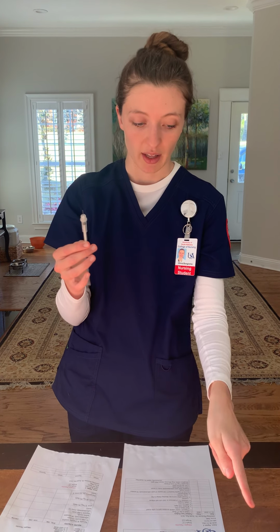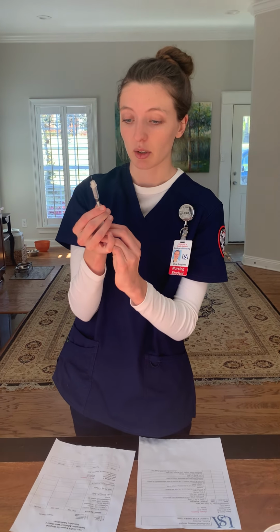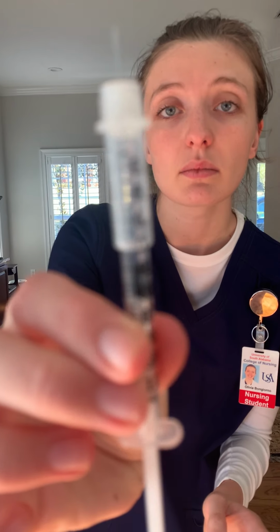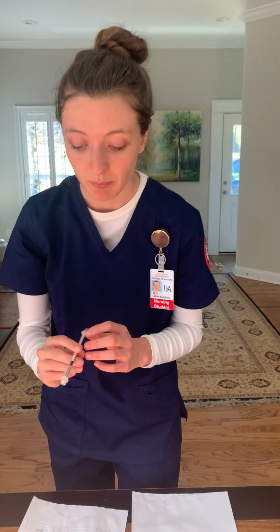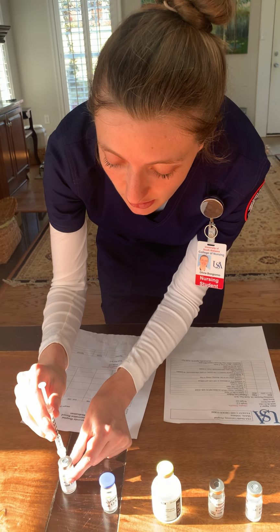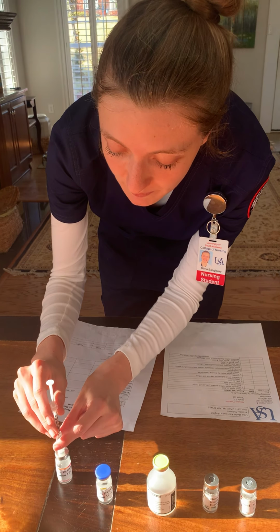And then I put that into the sharps container, and then I will draw in 0.5 milliliters of air because I want 0.5 milliliters of heparin. So I will then place my needle into the vial.